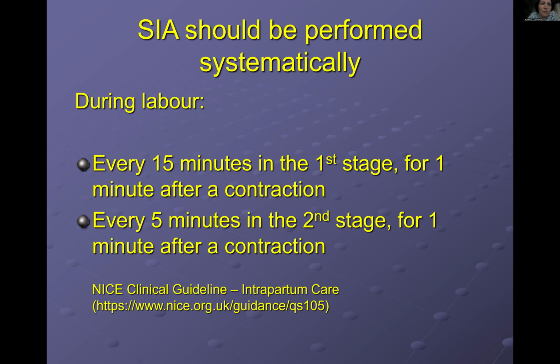And the recommendations are taken from the NICE guidelines. NICE stands for the National Institute of Clinical Excellence, and they're issued from the United Kingdom. We in Malta, being a Commonwealth country, follow quite a lot of guidelines issued by the UK. To be honest, these guidelines are also very similar to those in mainland Europe. And again, they are guidelines, so depending on the patient, you might need to adapt them accordingly.